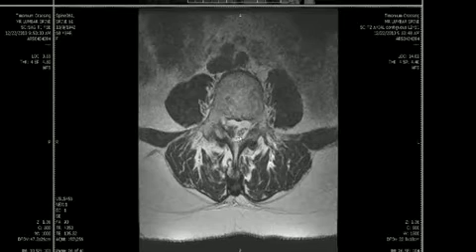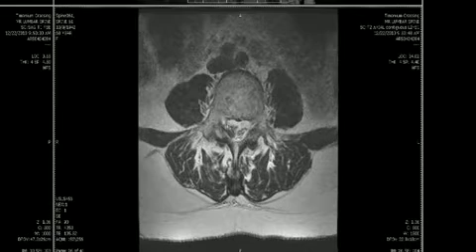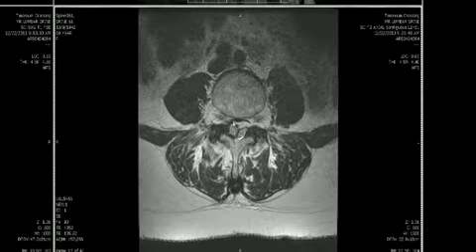If we try to follow the L5 nerve root back to the thecal sac, we can see it is being compressed by the mass. This raises the question of what accounts for the low signal intensity around the periphery of the mass.